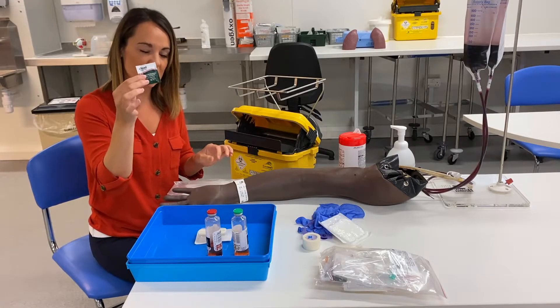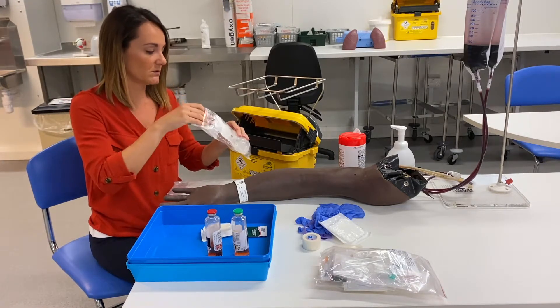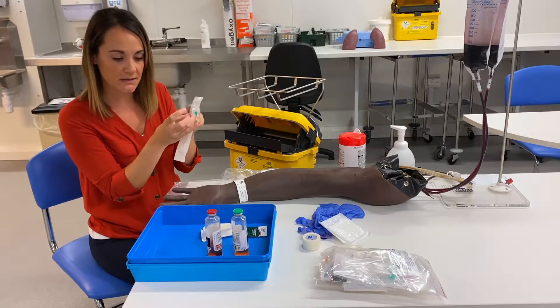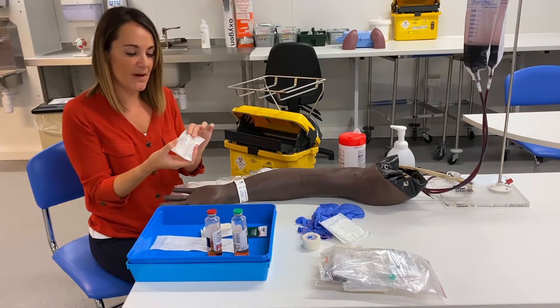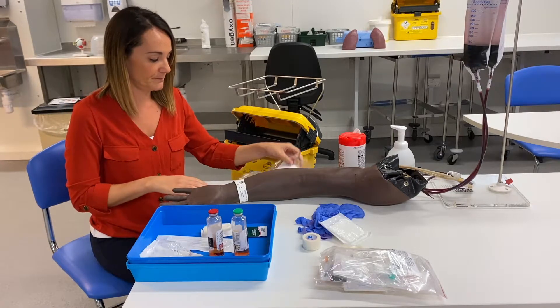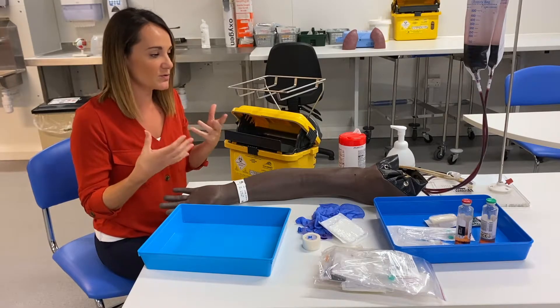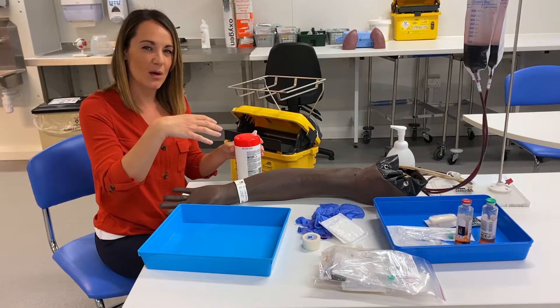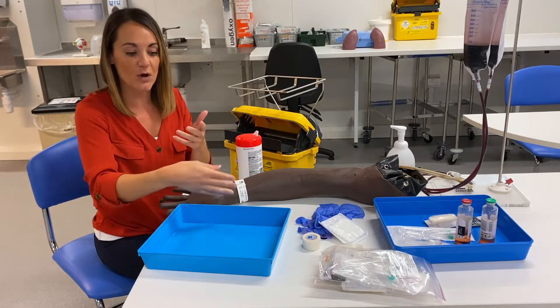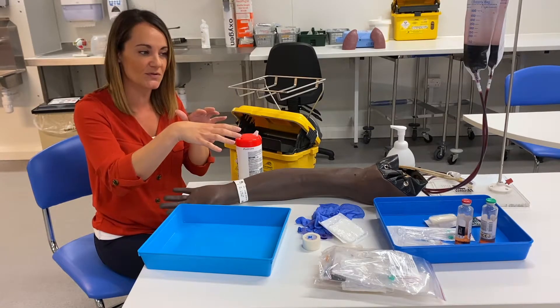We use this wipe to clean the top of the bottles. In the second bag — nobody knows what to do with that second bag — we have our butterfly needle and our key part, part of our ANTT connector. We also have our barrel that we use to attach our bottles, and on there, our key part is that bit there. It's really important to prepare everything by the patient's bedside. Once you've cleaned the top of the bottles, if you're walking over to the patient they might fall over in the tray, and the tray isn't sterile — it will just be clean — so you'd have to start the whole process again. Put together your key parts and clean the bottles by the patient's bedside.